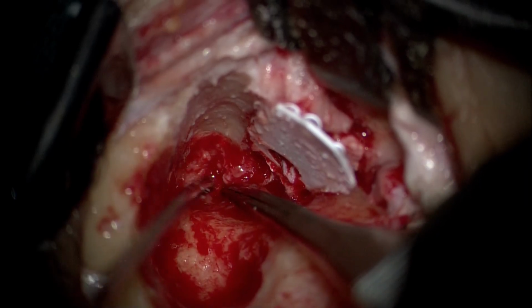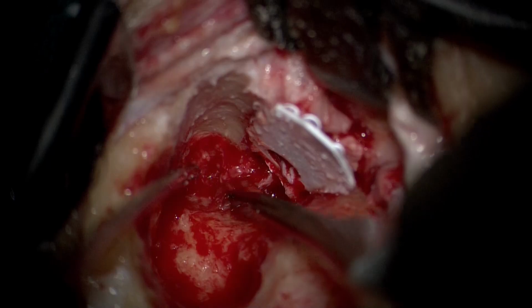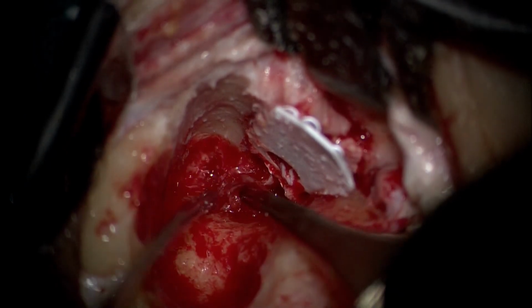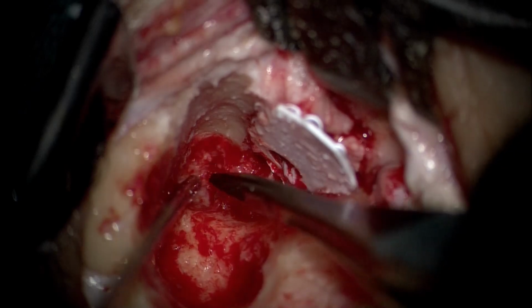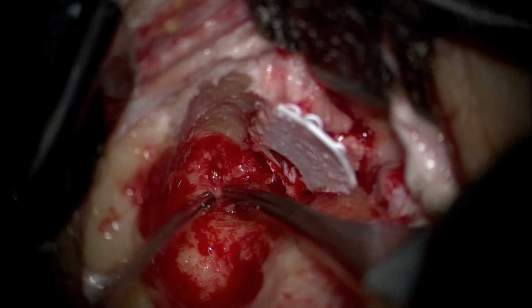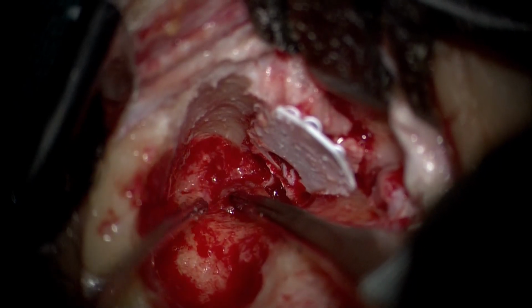The choice of suction is very important. Use generally a blunt suction, a thin suction, and to maintain optimal vision, one of the assistants can continue to irrigate gently, drop by drop, so as to maintain a clear vision and not have a field which is soaked in blood.